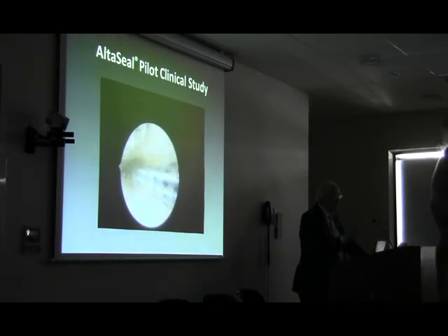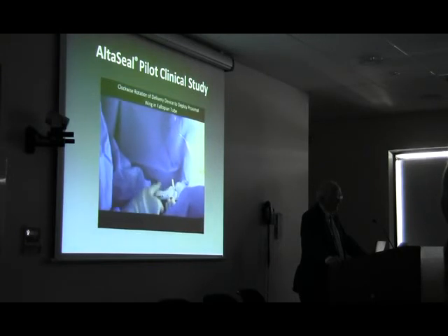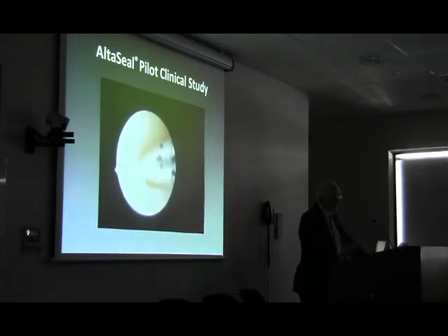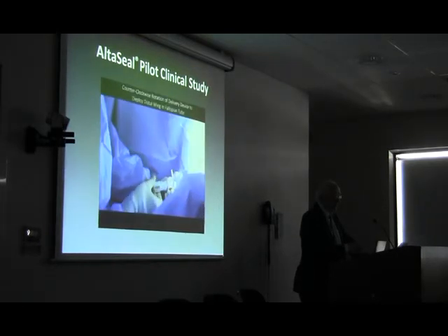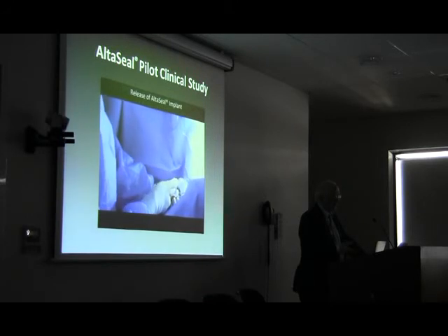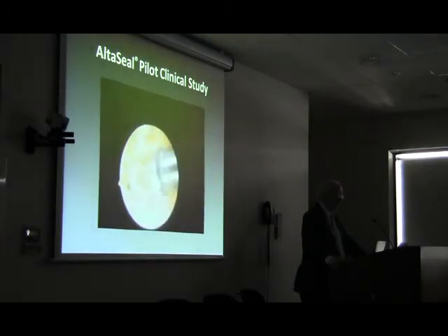This is the little gadget, and it's just about big enough that you just coax it into the tube, and we push it in there until the wings are completely inside, and then just rotate. We'll deploy one wing, boom, and there you can see where the wing is deployed, and just rotate the other way, and it'll deploy the other wing, and then bing there. That cuts off the guide wire, and you're left with a little gadget inside.